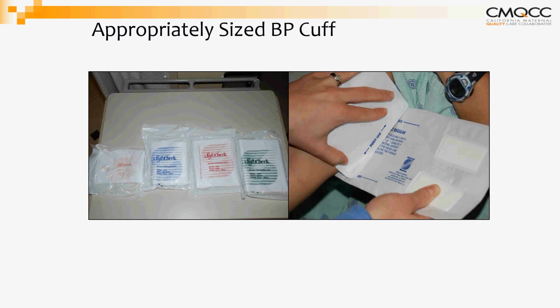The other thing that's really important is also to ensure that you have appropriately sized blood pressure cuffs. Some facilities may have automated blood pressure machines. It's still really important to make sure that you have different size cuffs, because as you know, we're not all the same size. And if you have the wrong size cuff, again, it's going to cause the wrong reading, and again, can lead to either missing something that would be managed, or masking what could be really a severe range blood pressure or an increased blood pressure.